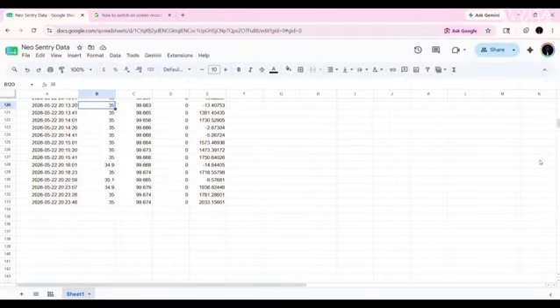This is the live screen for Neo-Sentry data in Google Spreadsheet. Here it gets updated every 20 seconds along with the live timestamps. It shows data for temperature, pressure, humidity and mobility.